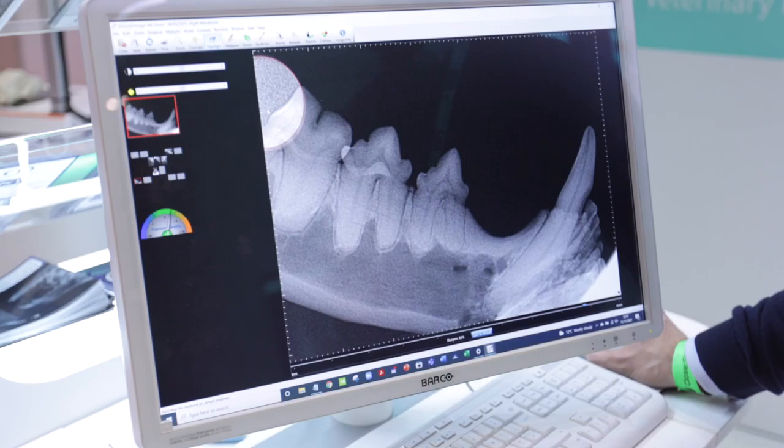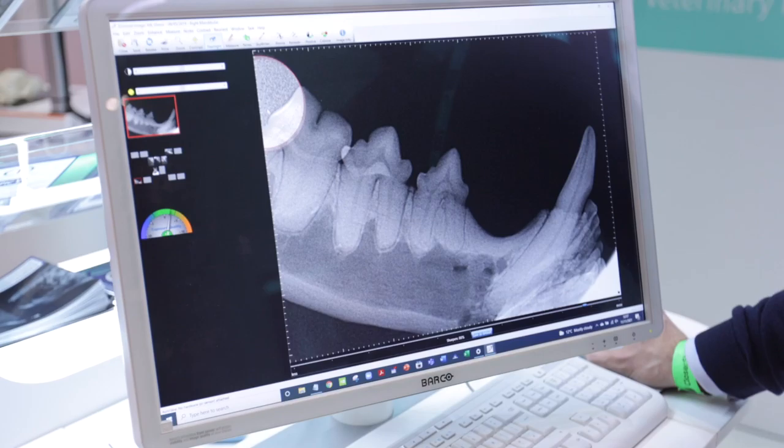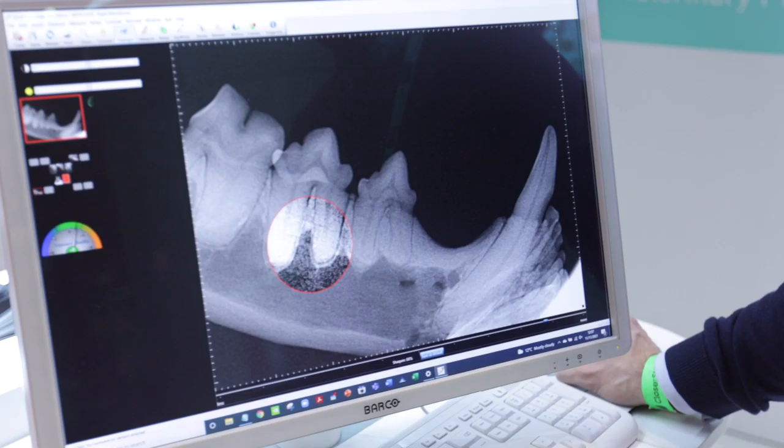You also have this flashlight tool which inverts the colours, allowing you to check the periodontal ligament more clearly — particularly useful for checking for resorption on the first premolar in cats. So these are just a couple of nice tools which come with the software itself.